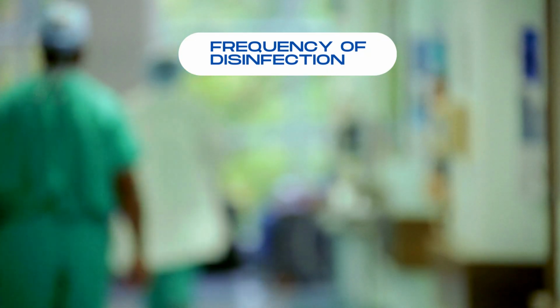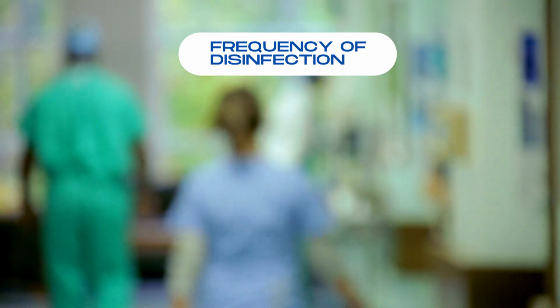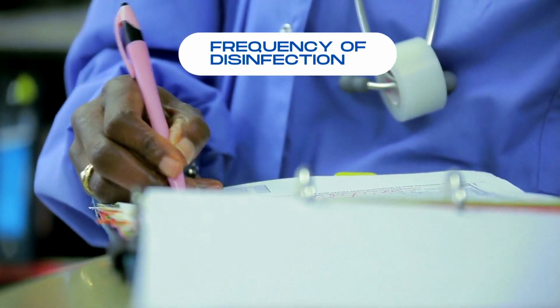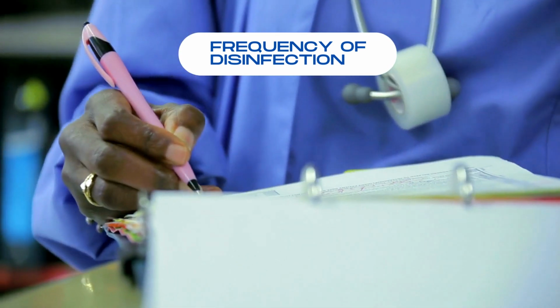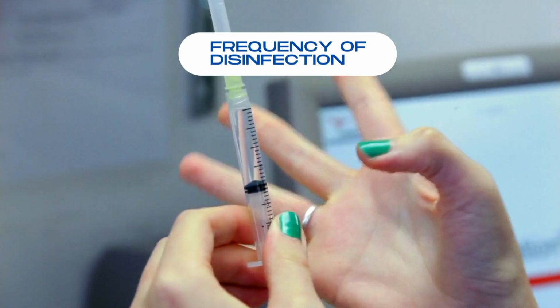The surface and environmental disinfection should ideally be carried out every alternate day. In case the disinfection is carried out weekly, then the strength of the solution to be used for surface and environmental disinfection is 2%. Articles suitable for surface disinfection are sink, waste receivers, operation theatre table, lights, furniture, floor, walls.